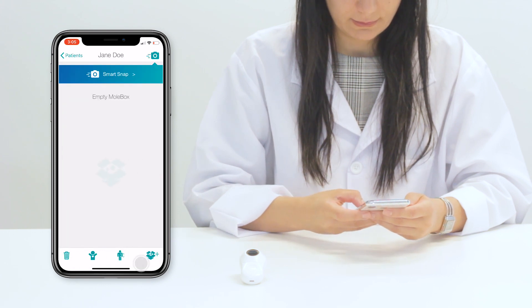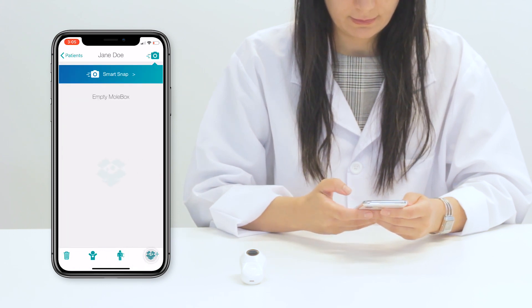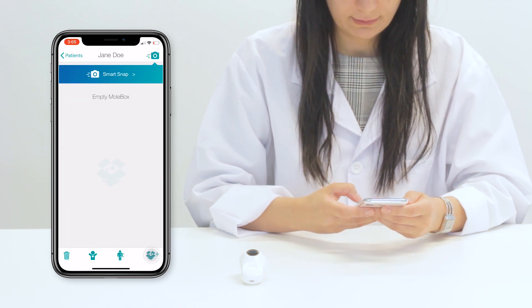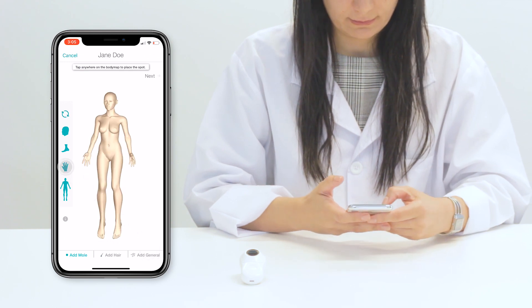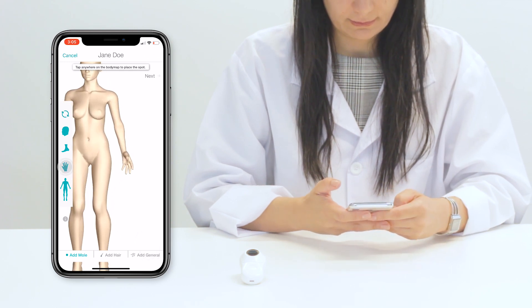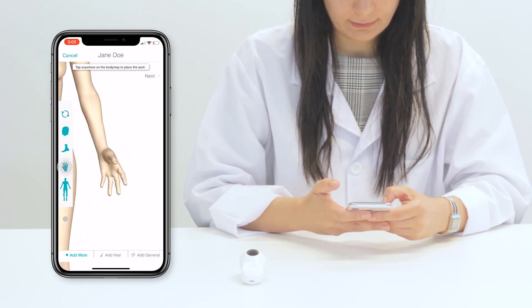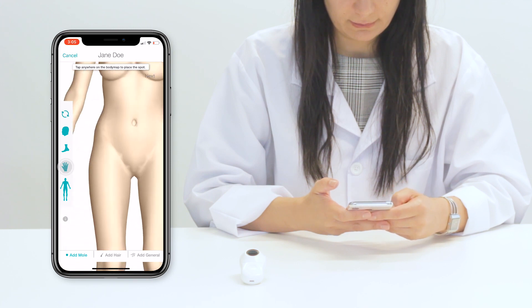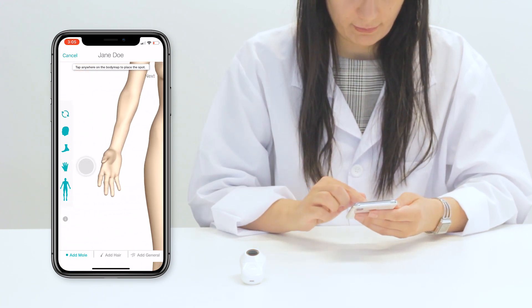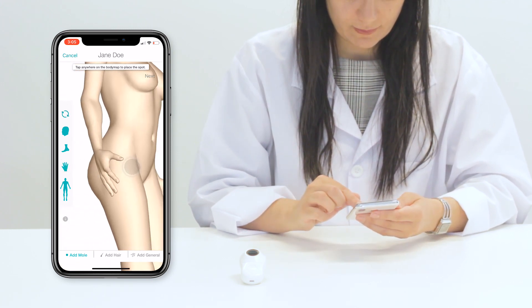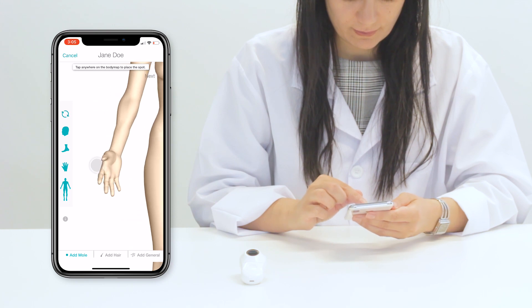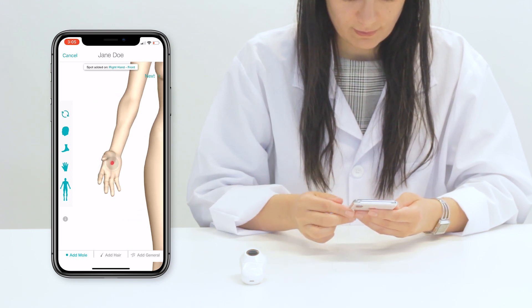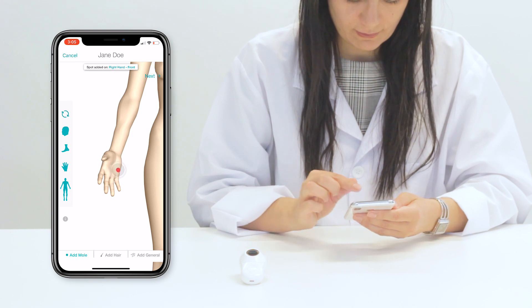To add a spot, press the mole box icon. Next, use the body icons or pan around to center the camera over the desired area. Tap the area to place the spot. Don't worry if you make a mistake — simply press again to relocate the spot.